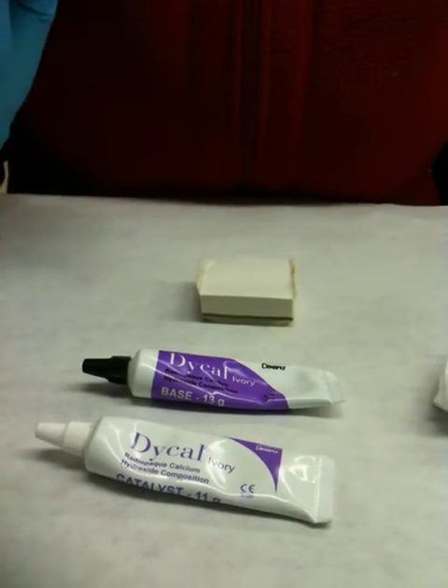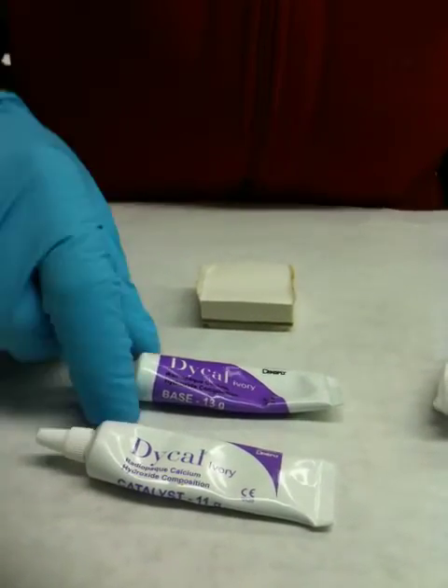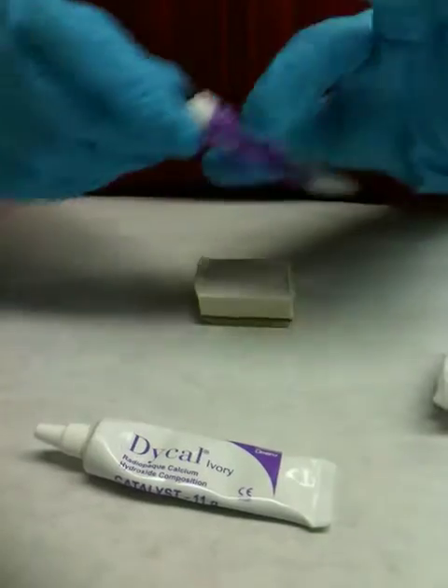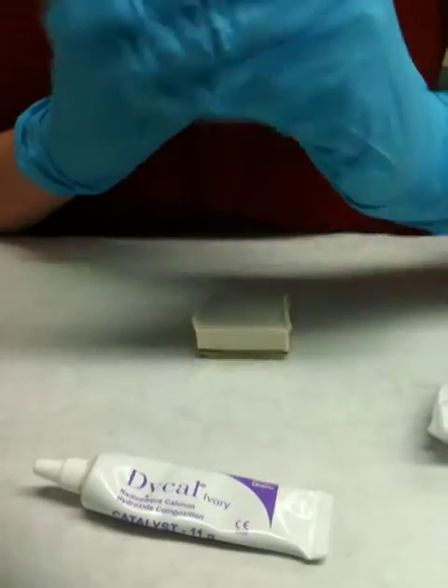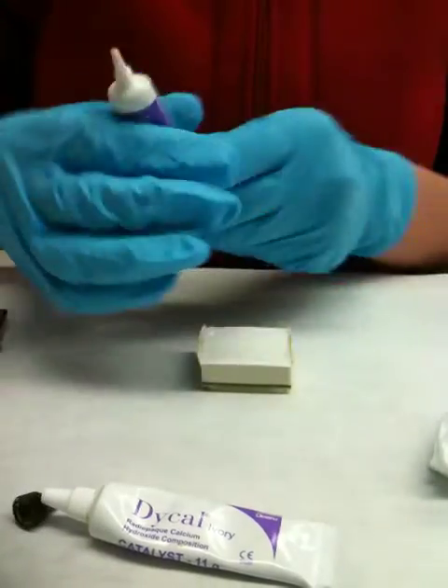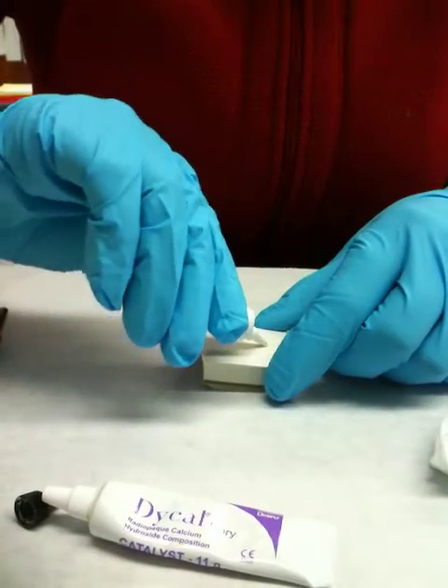I'm using calcium hydroxide liner, and it's Di-Cal. First I'm putting my base down — the purple tube. Just a little dot.